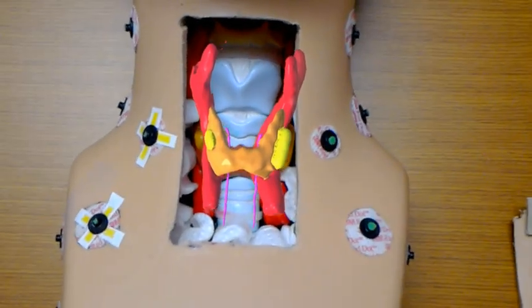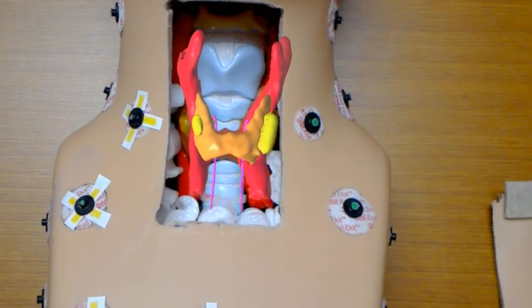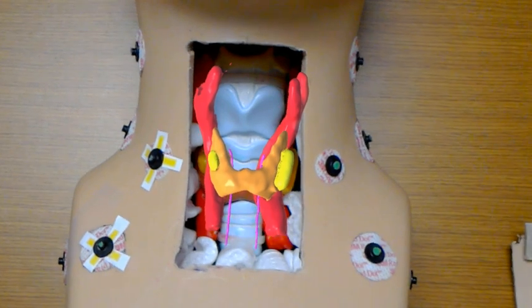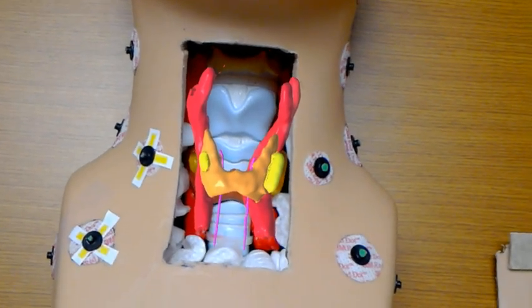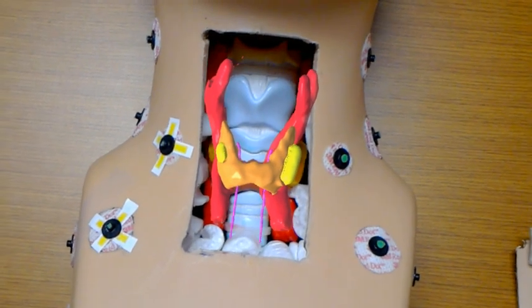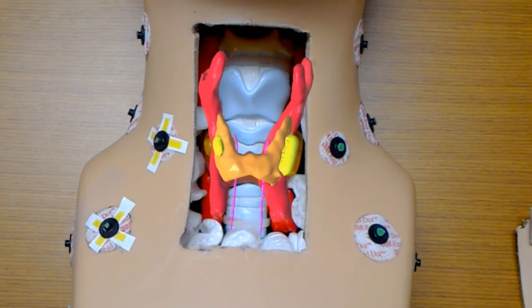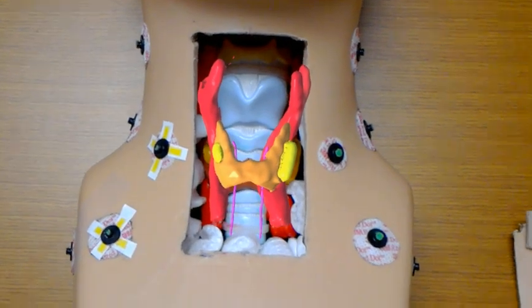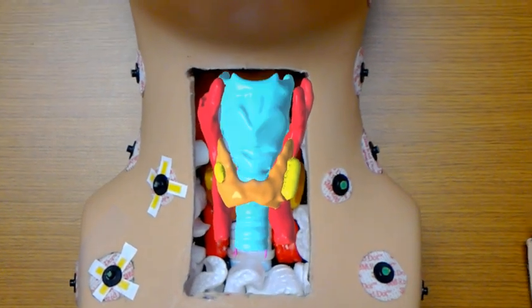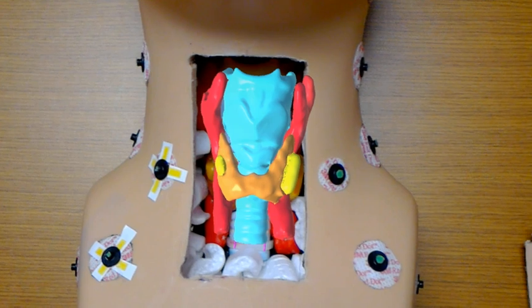One of the things I do want to point out is that the camera on the HoloLens that's in my forehead area is what's capturing this, and so it doesn't line up exactly as the images I'm seeing through the lenses. So that's important to remember, although during our project we were able to demonstrate about 1 to 3 millimeters of accuracy. Airway on.